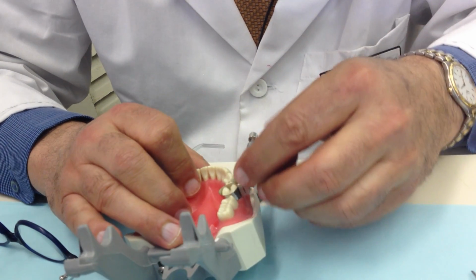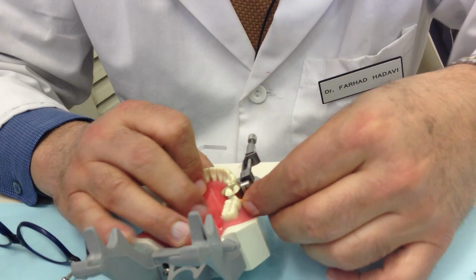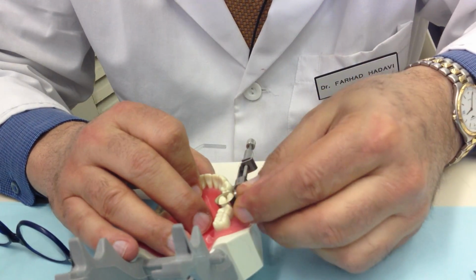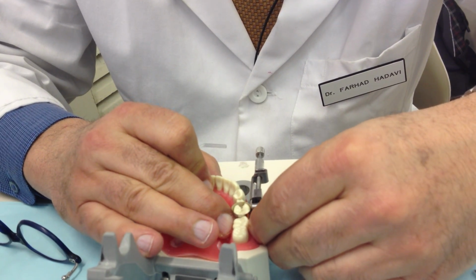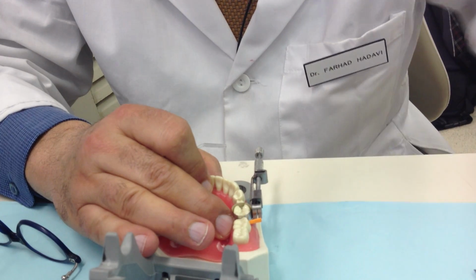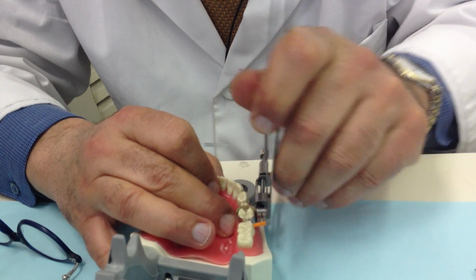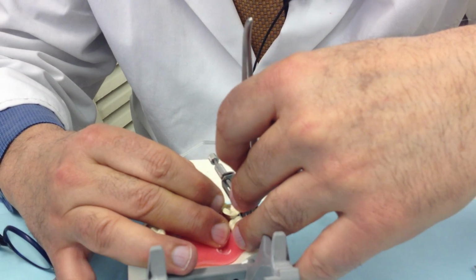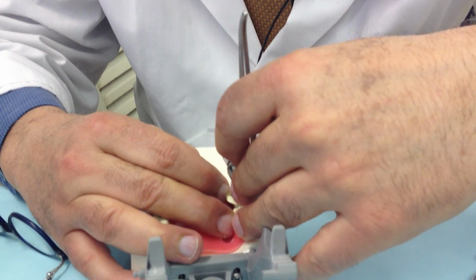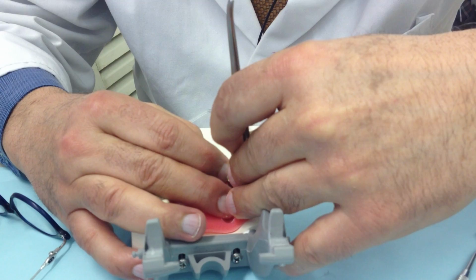Then I place my wedge in place. Now I know this wedge nicely fits exactly where I want it to fit, correct? I place my wedge. Halfway has to go through.